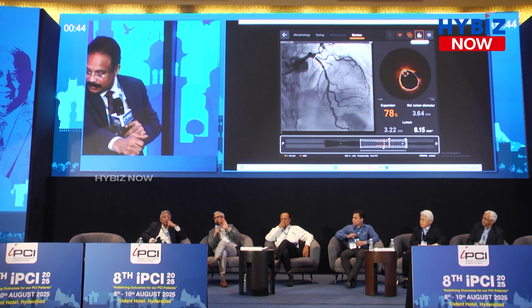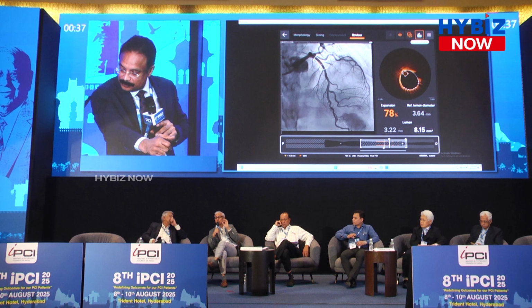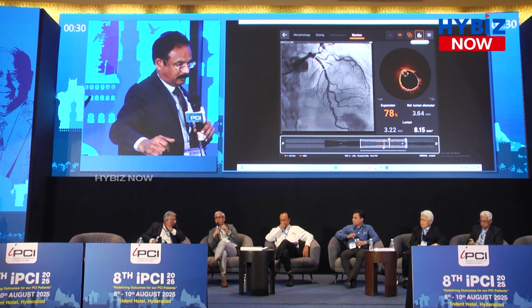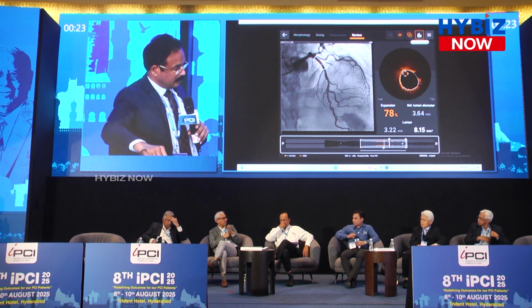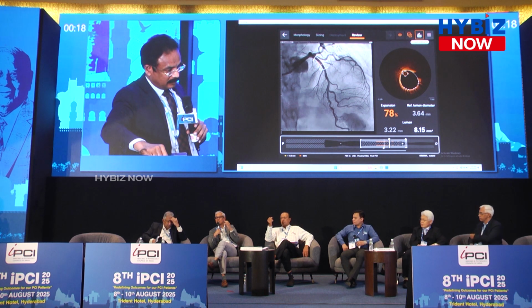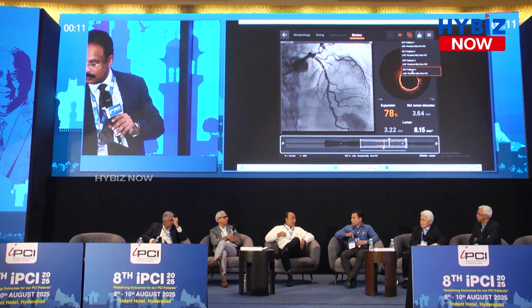If you look at the data, I think MACE is correlated with the MSA more than the percentage of expansion. And especially the calculated expansion can be flawed when there's elliptical expansion, which is quite common in calcific lesions, where the vessel expands more in one direction. So ultimately, what is more important is, if you get an MSA of 7, even if it shows you 70% expansion, I think it's an excellent result if you have apposed it well.